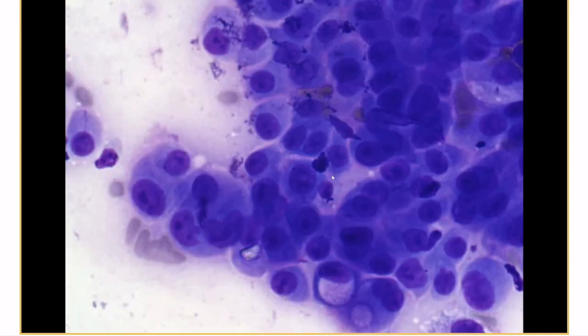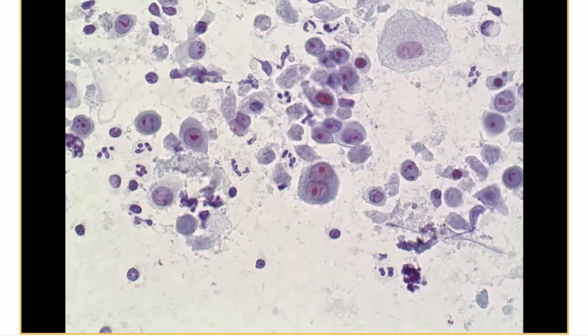You see more mitosis, some vacuoles, very prominent large nucleoli, necrosis in the background, very high degree of pleomorphism, some binucleation.